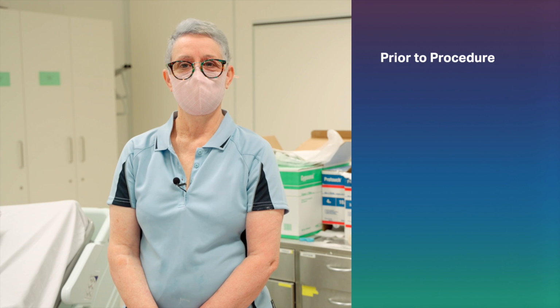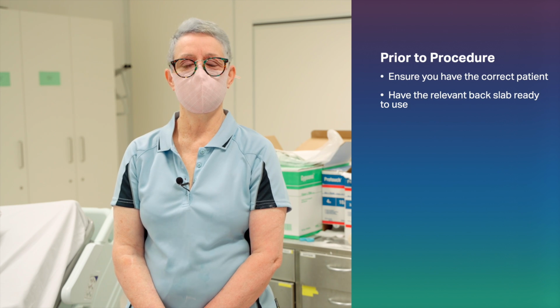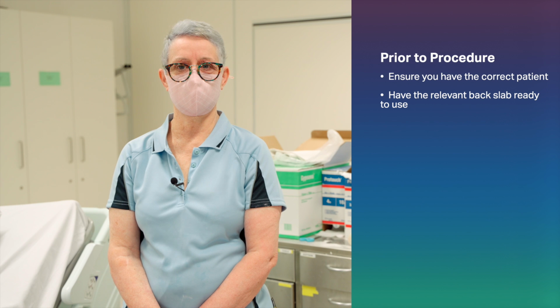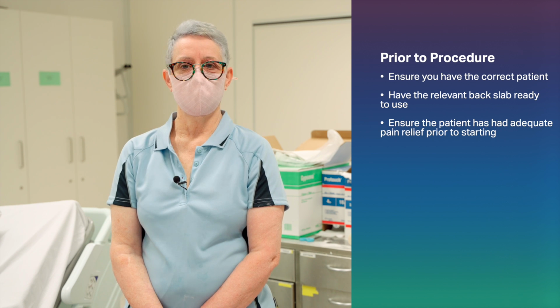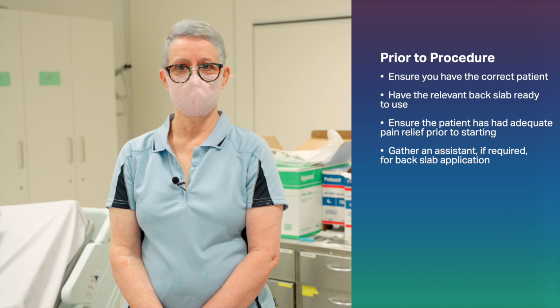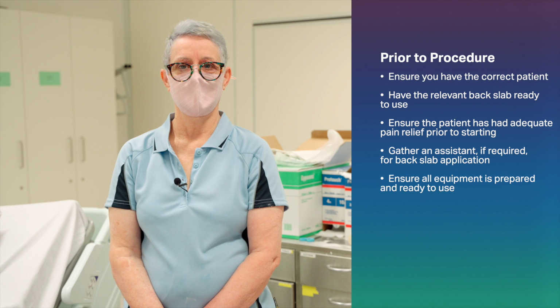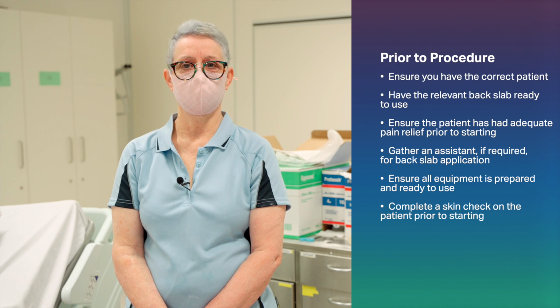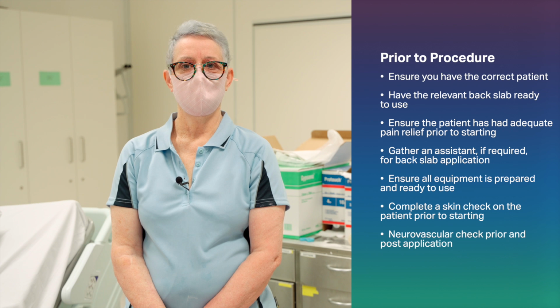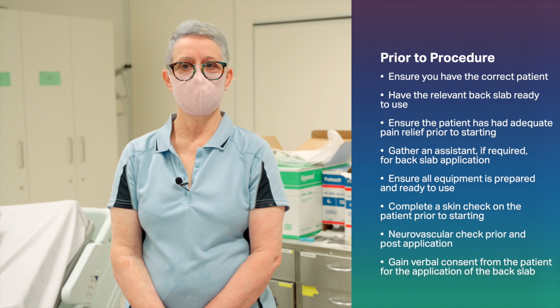So in recap, it is important to make sure that you have the right patient, that you have the right back slab for the particular type of fracture, that you give the patient adequate pain relief prior to starting, that you gather an assistant to help you put on the back slab. Make sure you have the correct equipment ready to go. Make sure that you have done a skin check. Also, a neurovascular check prior and post application. And importantly, have a consent verbally from the patient to the application of a back slab.